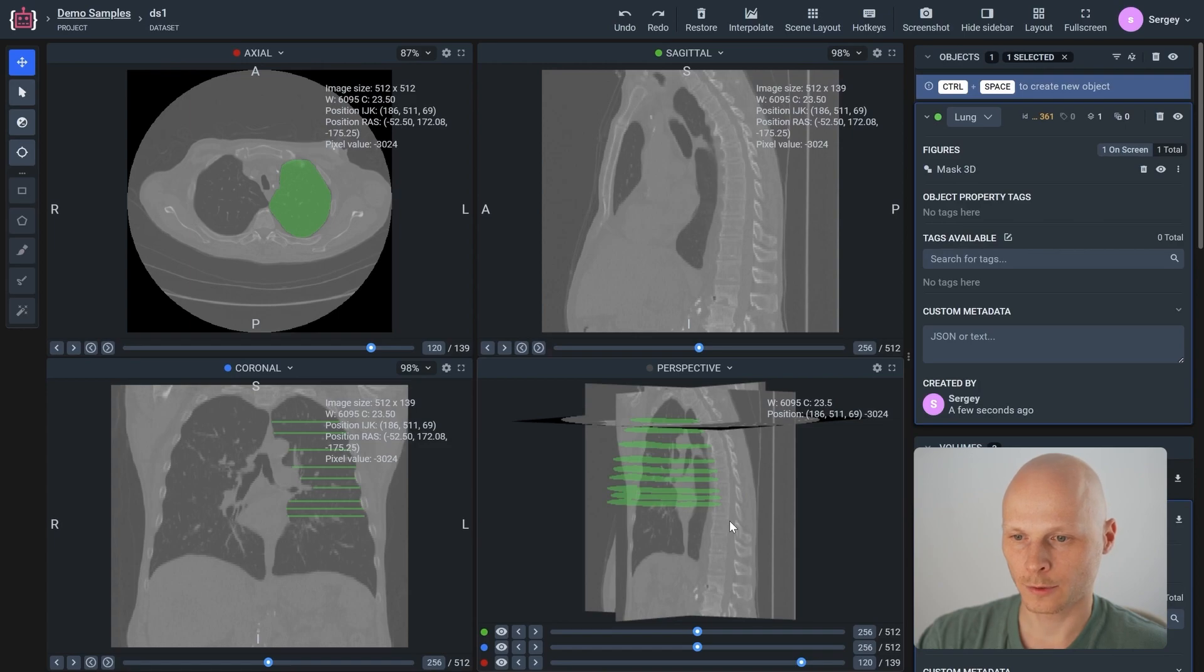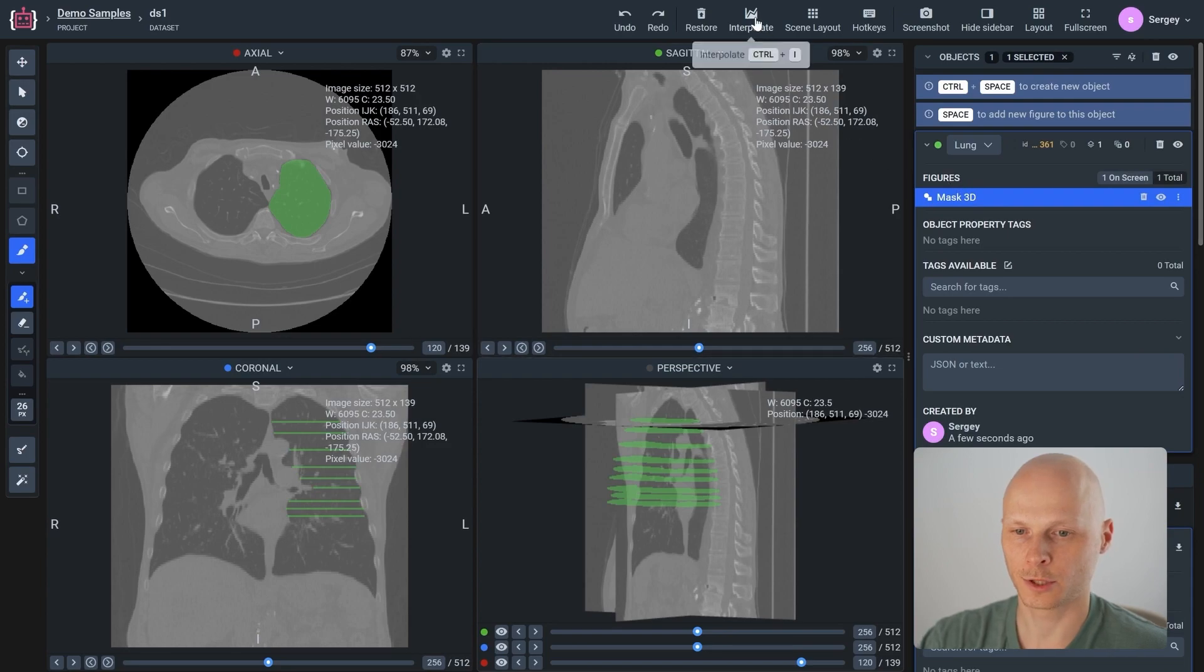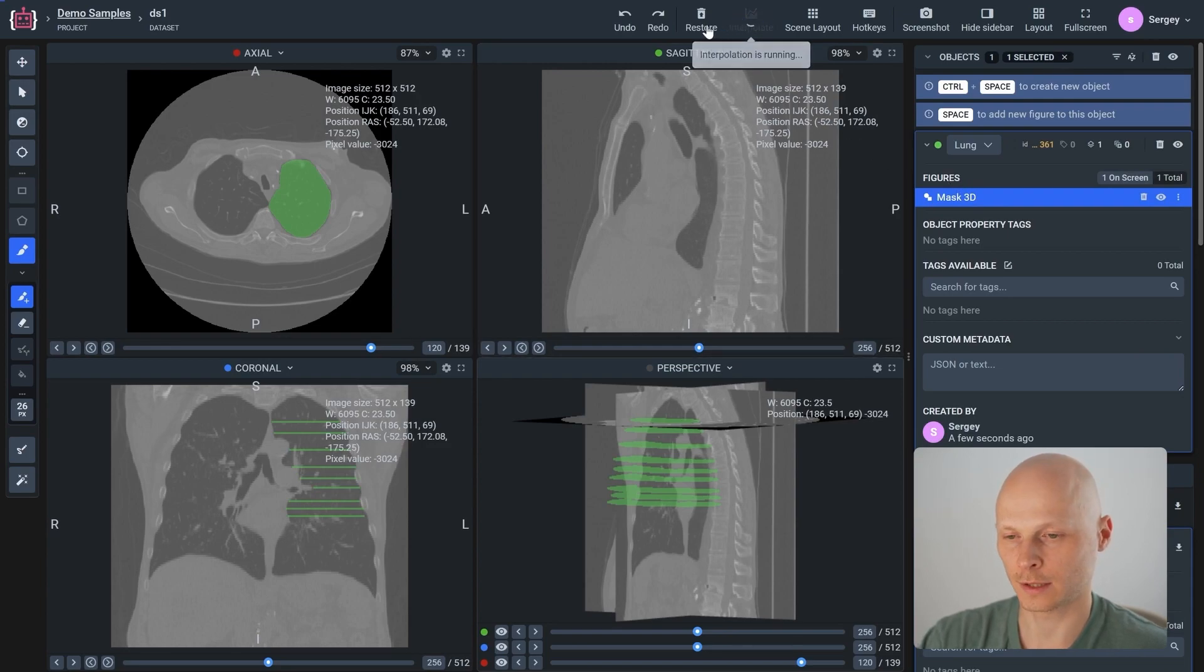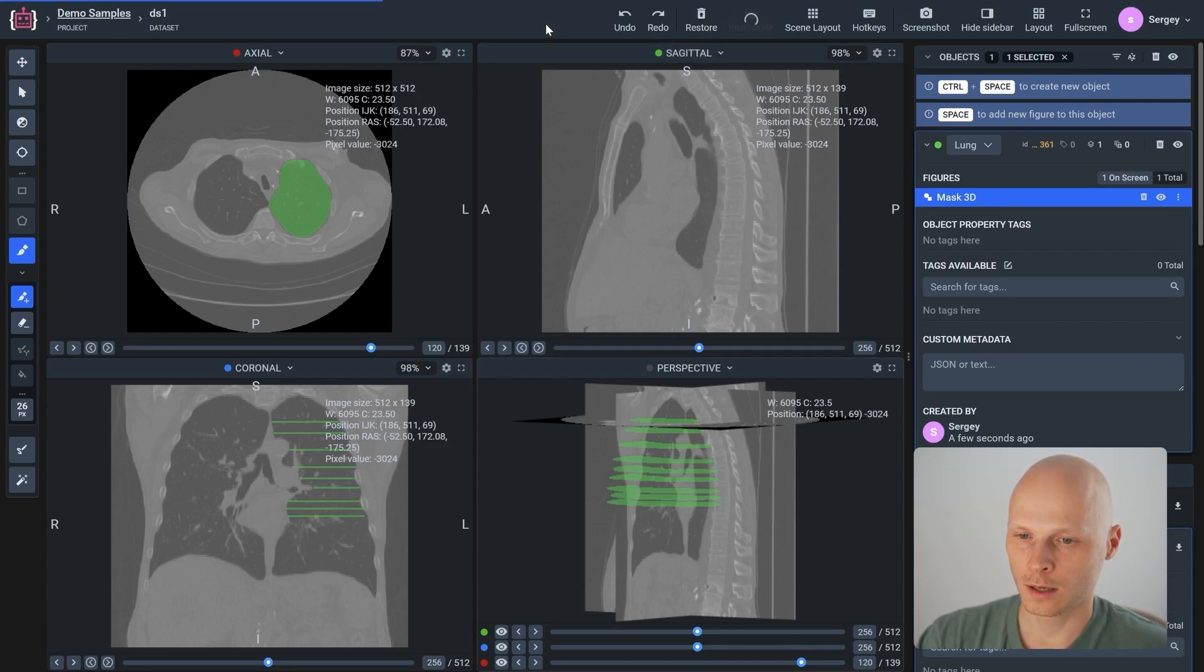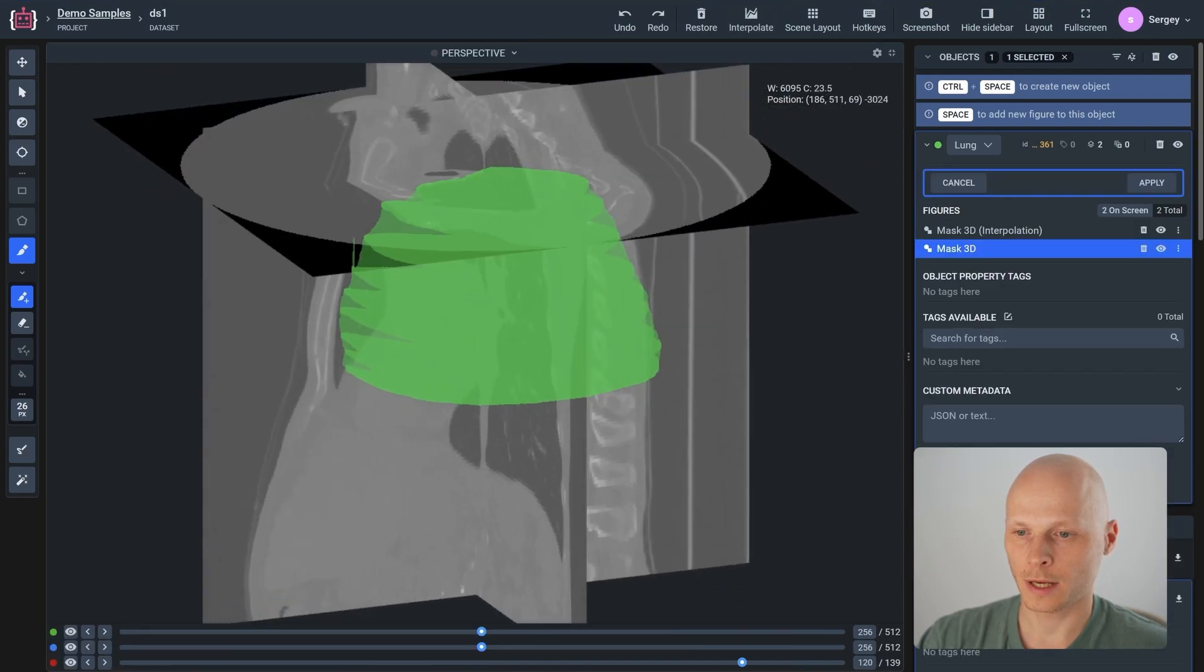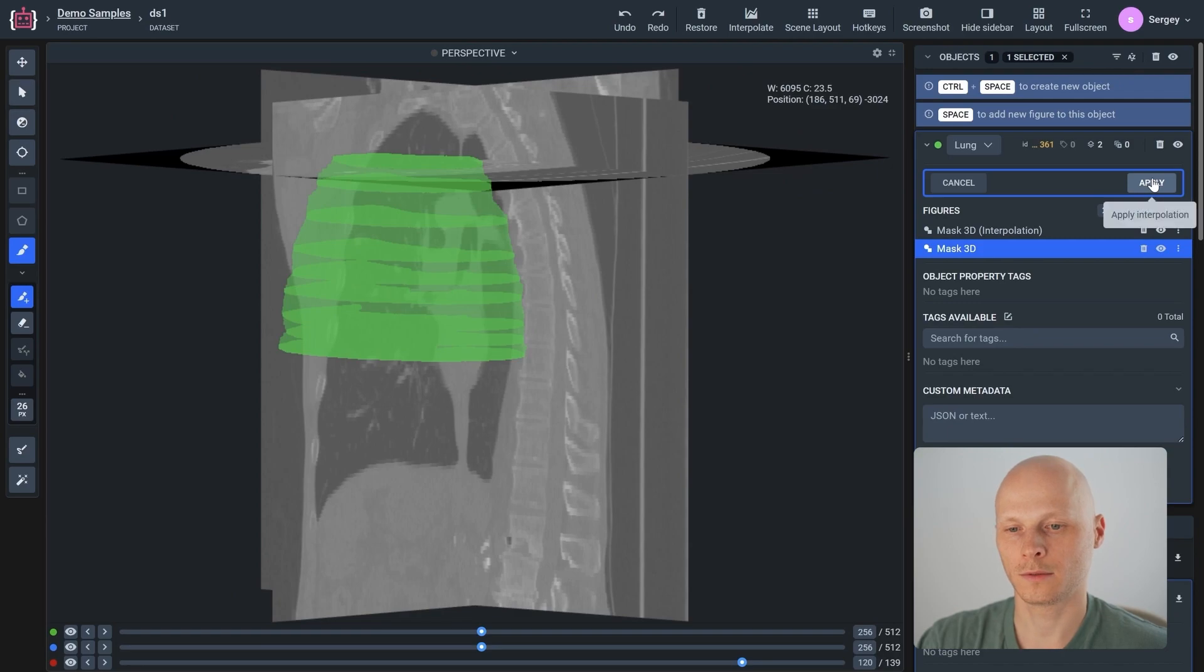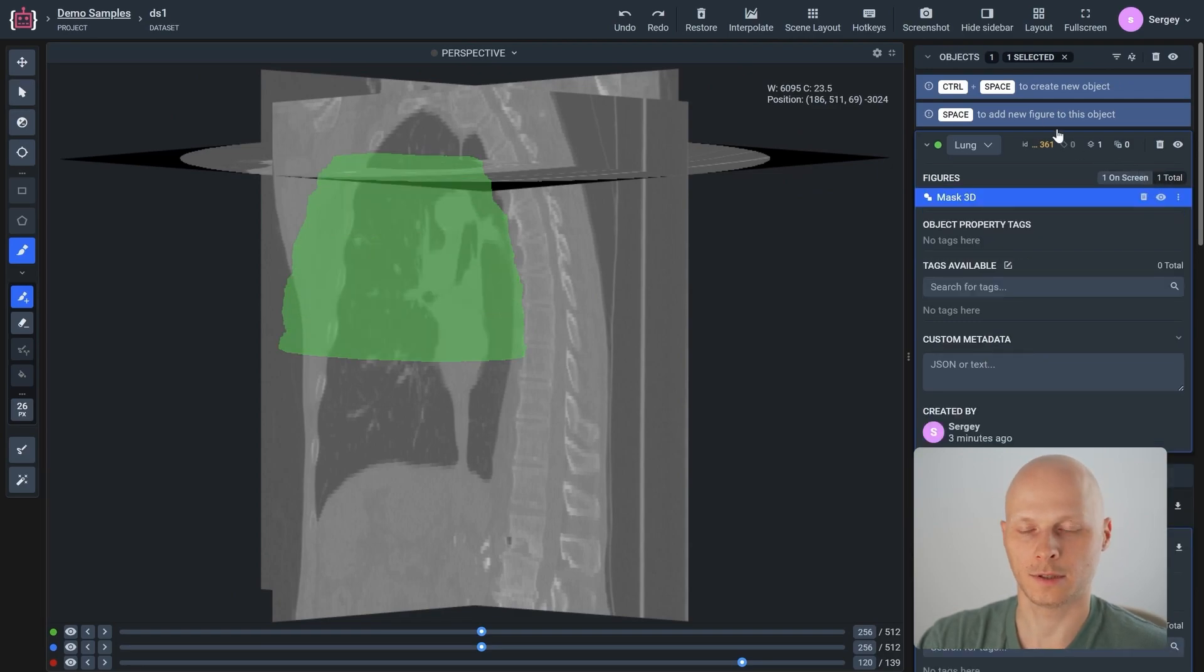To fill the gaps, we can start the interpolation tool, which will reconstruct the objects on missing slices. We can apply or decline the result and continue working with it. Let's apply this 3D object.